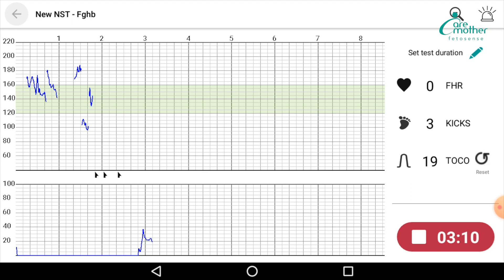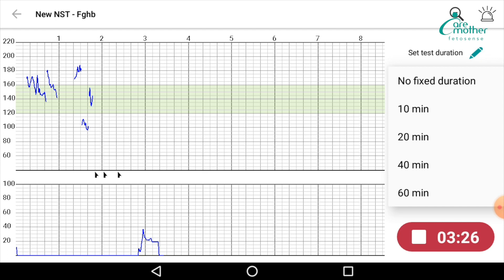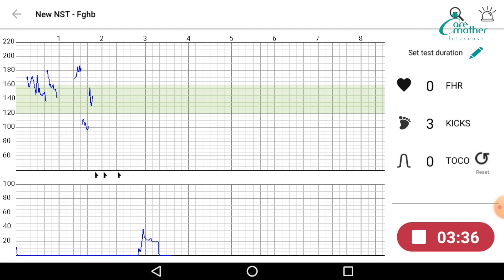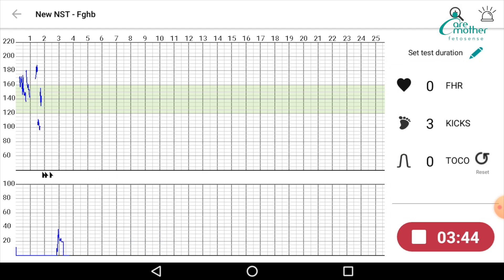If at any point you feel the TOCO is not right, you can click on the round button next to TOCO and it will reset the TOCO. Using the pencil icon, you can also set the test duration — it can be set to 10, 20, 40, or 60 minutes. If you are doing labor monitoring, you can fix it to no fixed duration. You can also maximize or minimize the scale of the test using the minus button to see more of the test on one page.